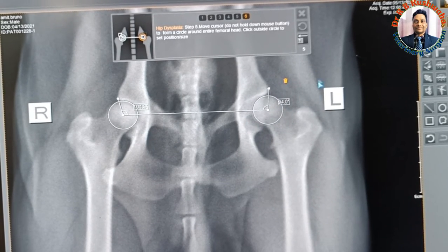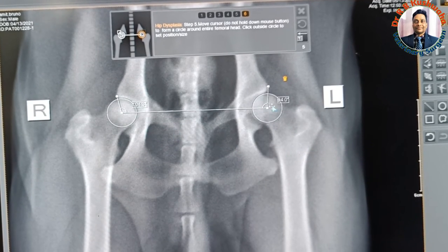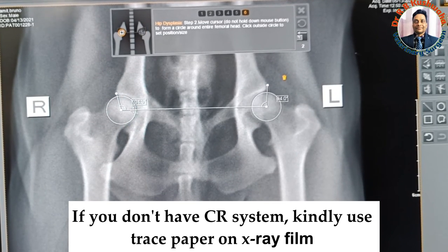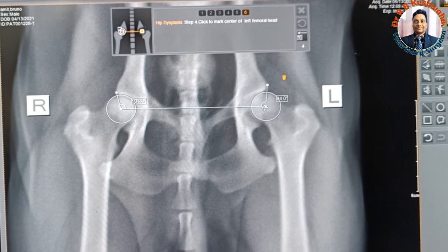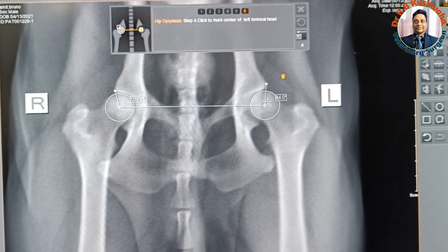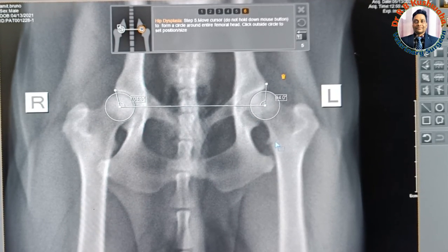This is how you can measure the Norberg's angle on the CR system. Suppose if you don't have the CR system, you can measure by putting tracing paper over the radiograph — just take the diameter of each femoral head, draw a line from the center of the right to the center of the left, then make a line to the cranial edge and measure the angle.